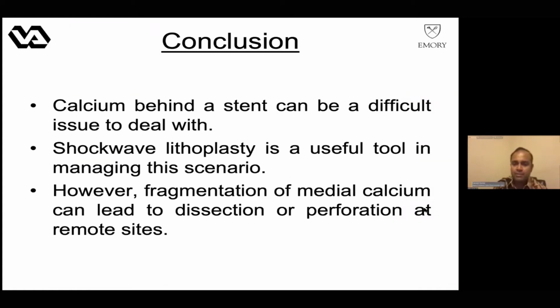However, fragmentation of the medial calcium can lead to dissection or perforation even at sites that are remote from where you're treating. And it's important to be aware of where this entrance is, like what Prof. Akiko talks about, so that you can treat the entrance and then deal with what needs to happen to the other remote site. And I think those are important things for advanced operators.